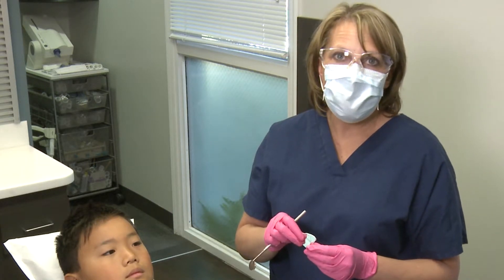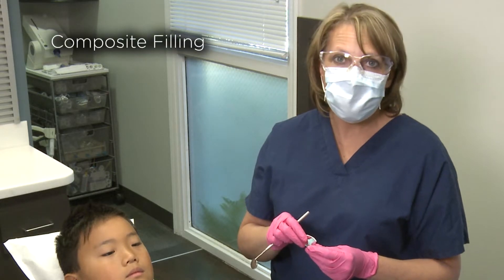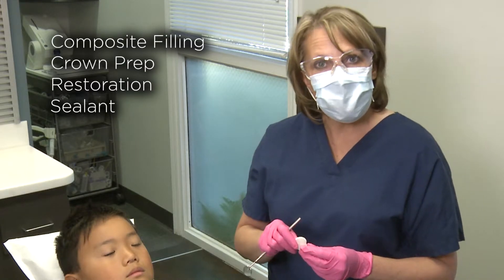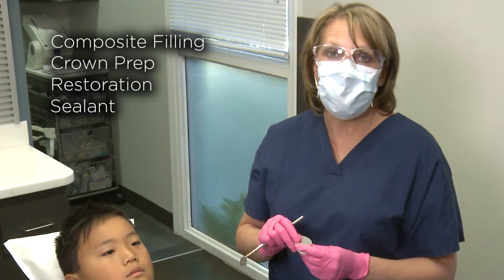This saves a lot of steps and hand motions for the dental professional, whether doing a composite filling, crown prep, restoration, or sealant. Its super absorbency prevents the need to change the cheek retractor in and out multiple times.